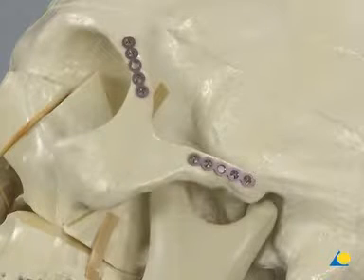Fixation of the zygomatic complex is repeated on the opposite side. A 0.7 mm thick plate is placed at the zygomatic frontal suture and another on the zygomatic arch.